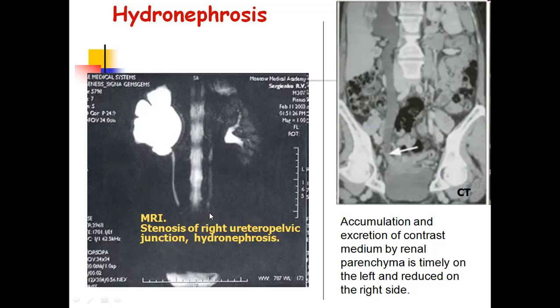And CT also is very helpful in assessment of the effect of hydronephrosis and its degree, its stage.